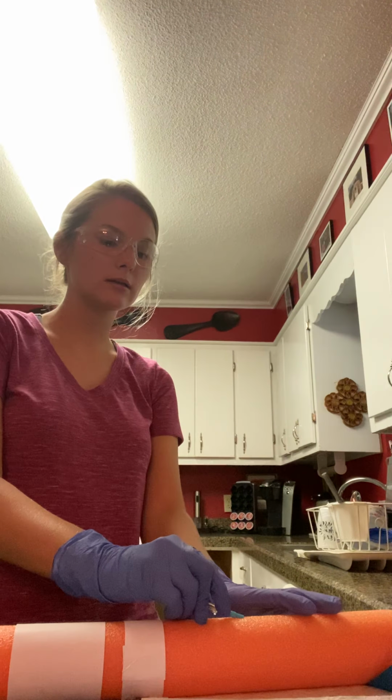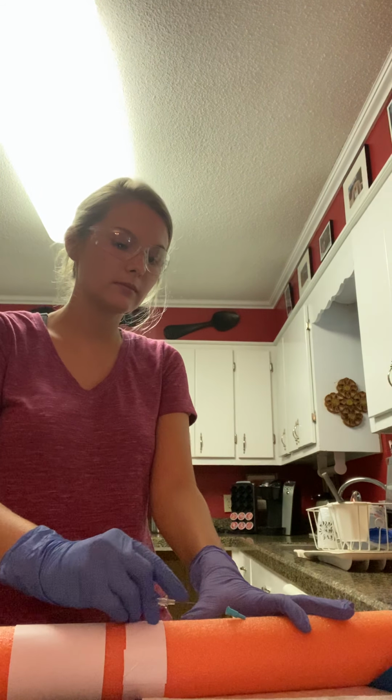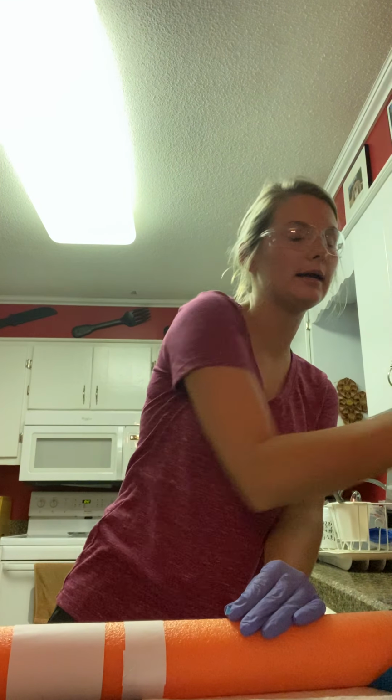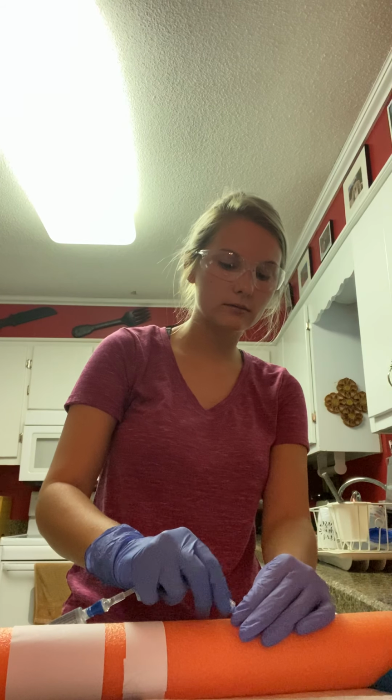Once the tourniquet is released, I would hold the skin tightly about 1 1/4 inch above the insertion site, and I would remove the needle. And then I would put the needle into my sharps container, and I would quickly insert the saline lock.